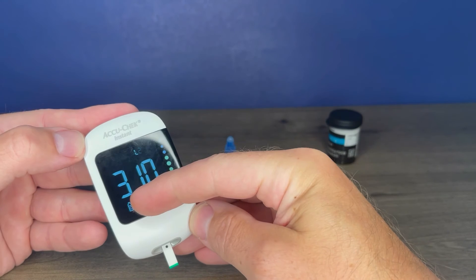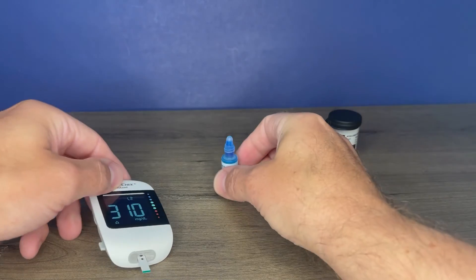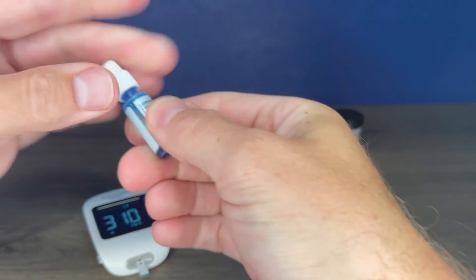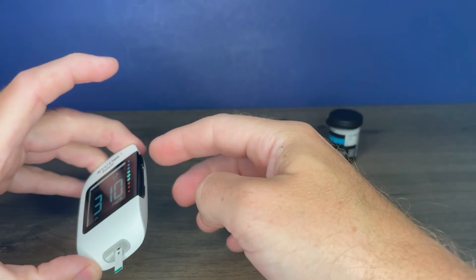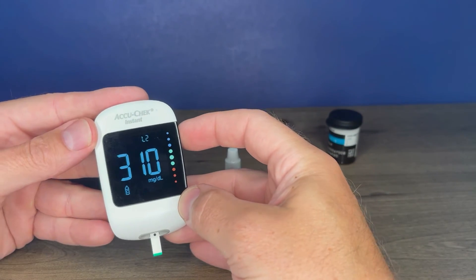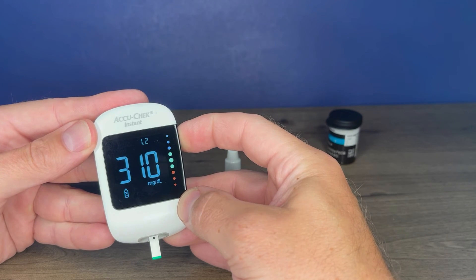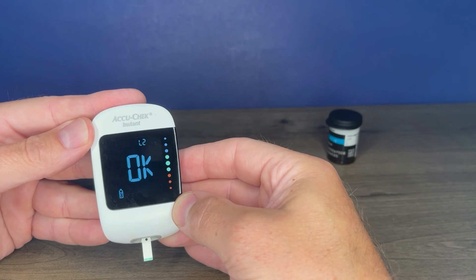It's sensing that it's control solution — you can see the control solution bottle icon there, and also that it's level two. This is level two, right there. If you needed to adjust that, you could press the up and down arrow buttons to change it to level one. Since it is level two, you can hold the top button. And that lets us know that's okay — we got a 310.